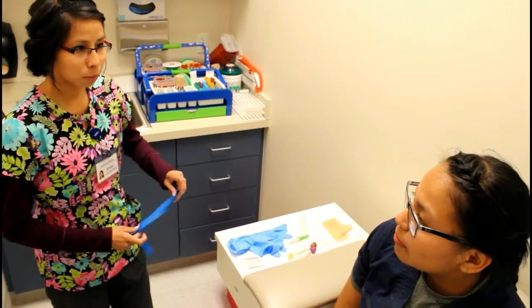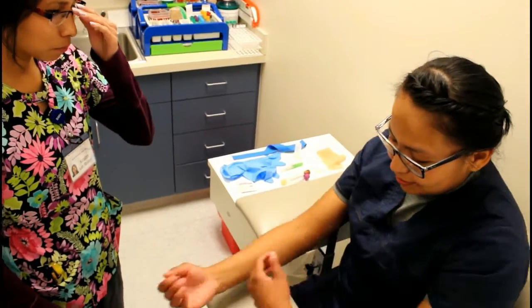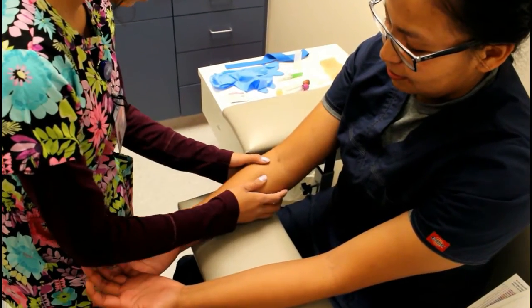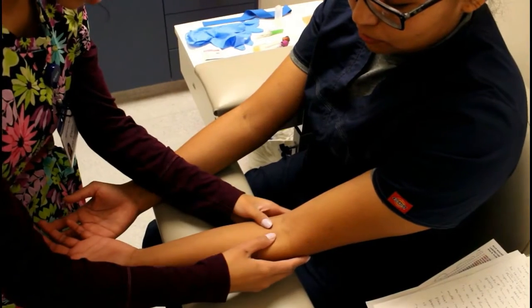Tourniquet application. Have you ever gotten your blood drawn before? Yes, this past Monday. Okay, may I see your arm, please? Okay, looks like you have a bruise over here. We'll try to go for this arm. Alright. Okay, I think I see one.